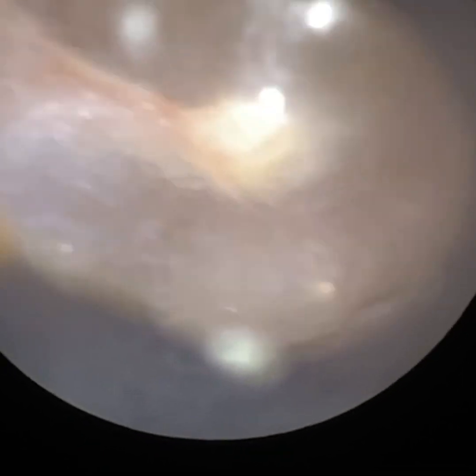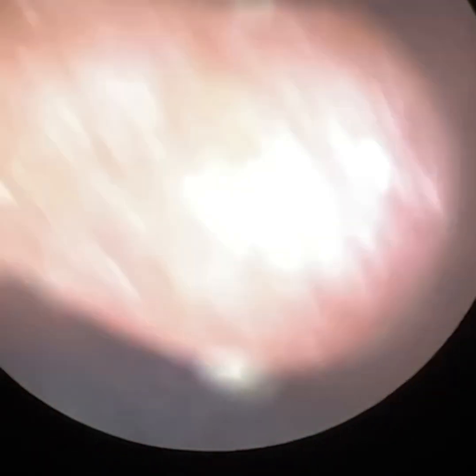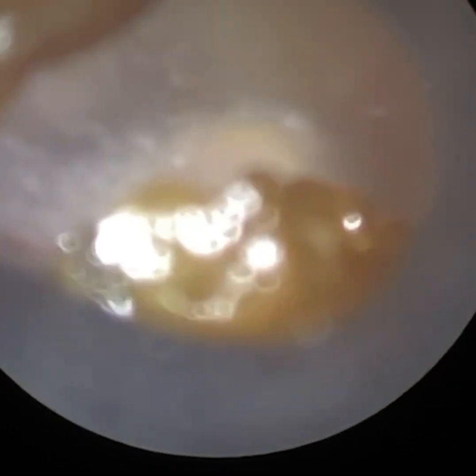The Waxscope is not designed to replace our flagship iClearScope, which is the wireless endoscope. You may have seen a lot of the videos with the endoscope — the field of view with an endoscope is quite simply unrivaled. But we have found that training with the endoscope can be a bit difficult for some people, because it just requires a lot of bilateral integration and coordination between your right and left hand, so some people just find that a bit more tricky.